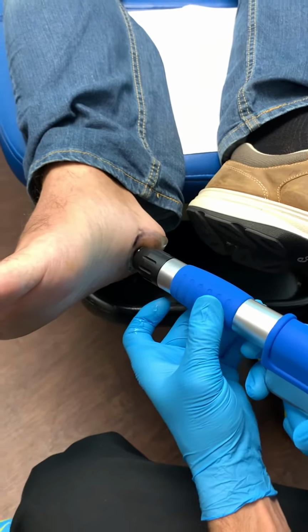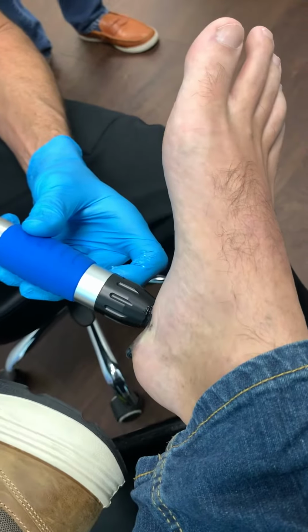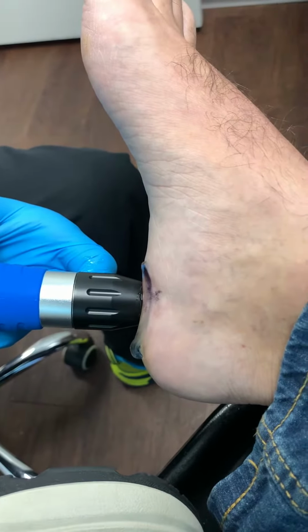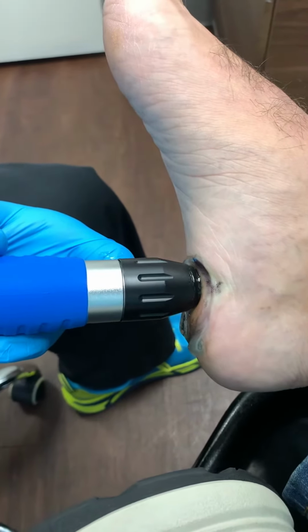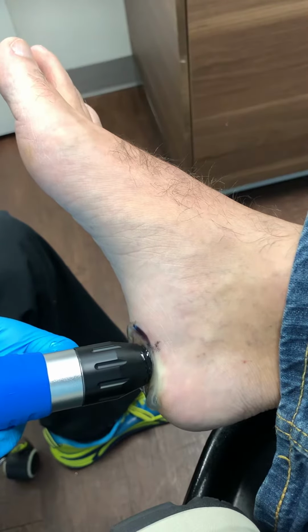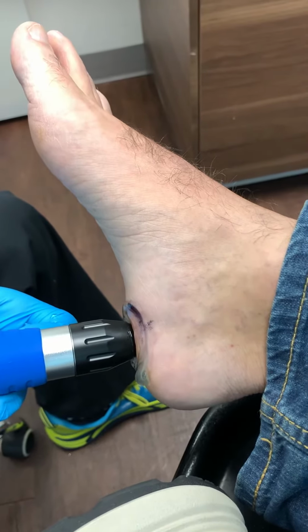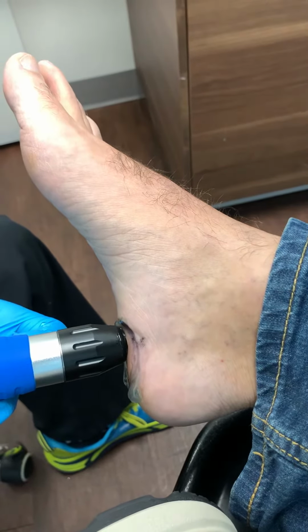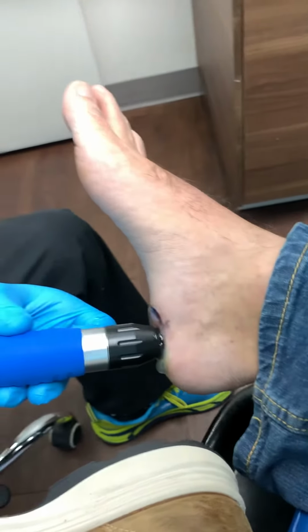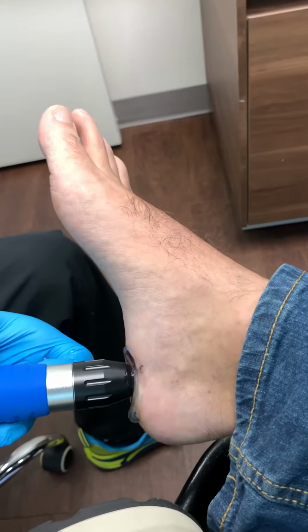I'm going to stop here and increase the frequency a little bit more. As everyone can hear now, the frequency of the pulse is a little bit faster. And again, as promised, I will definitely talk about how this works and why it works. It's a little bit similar to the percutaneous microtenotomy, the deep dry needling, with the physiological effects of bringing blood to the area, because blood is important to heal anything.